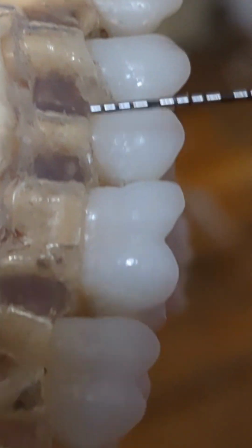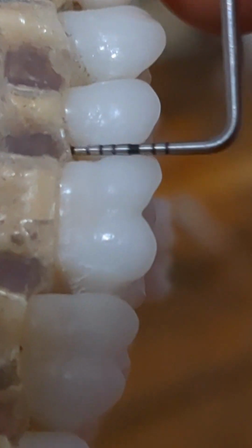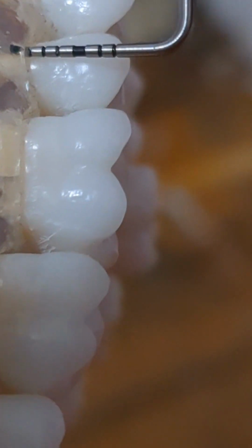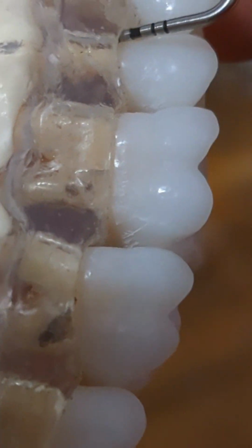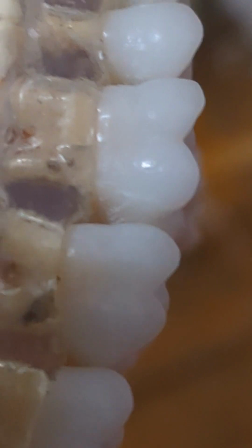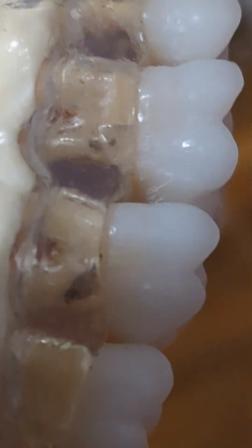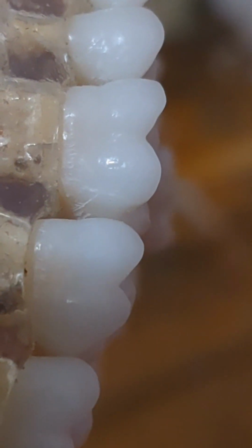Let's get a little closer. Yep. Right here. About a 7, walking back. 7, and then we have a 10. We have about a 9, walking back. We have about a 6 and then a 9. Sorry, about a 10. Okay.